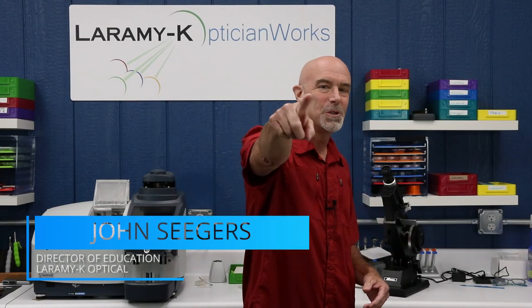Hello, I would like to welcome you to the Laramy K OpticianWorks Training Center, where today I'm going to take you through the steps of rebuilding a three-piece mount frame. You may also know them as fully rimless or drill mounts.